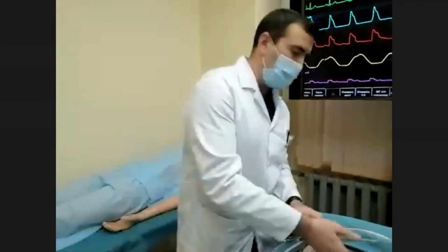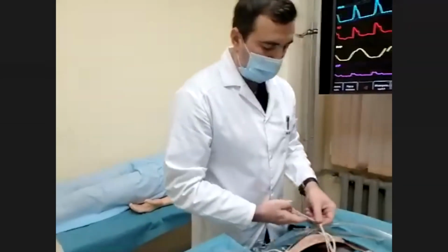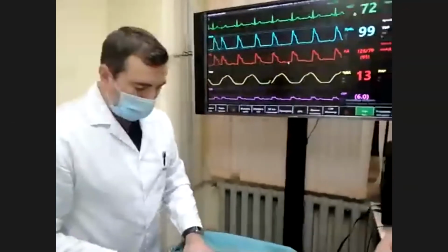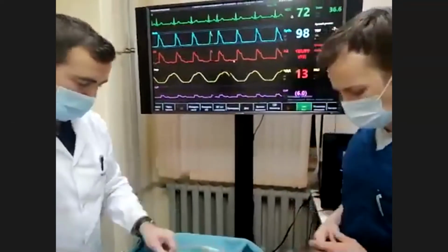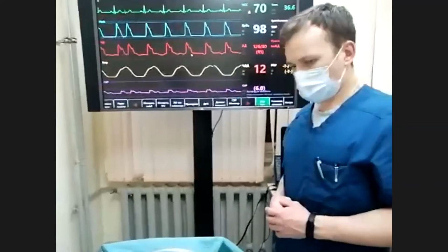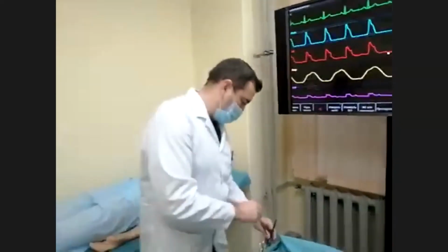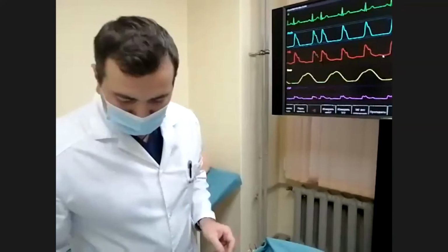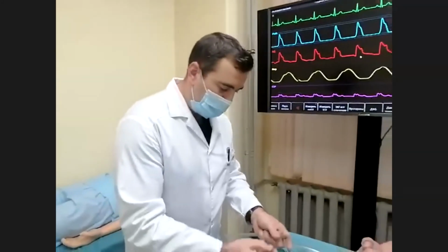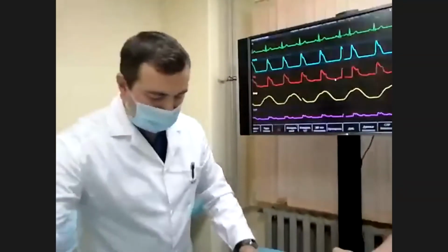Okay. So if we have the model with liquid circulation, we have the tubes without holes. You know, we make the real purse-string stitches here, and then I take the real knife, and then I do this procedure.